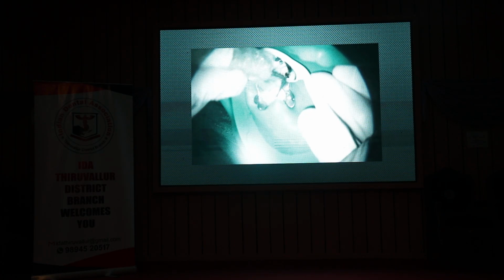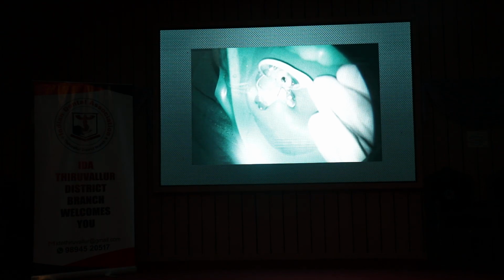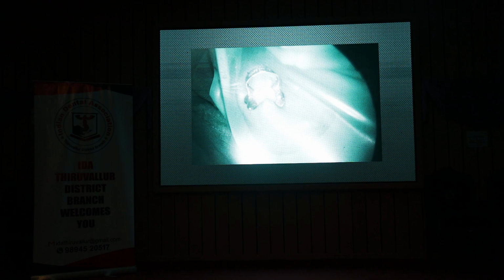The vibration is passed on. Did you notice it? The instrument just jumped out. So it is possible, in some cases it can occur like this, but another word of precaution: never attempt retrieval without rubber dam.